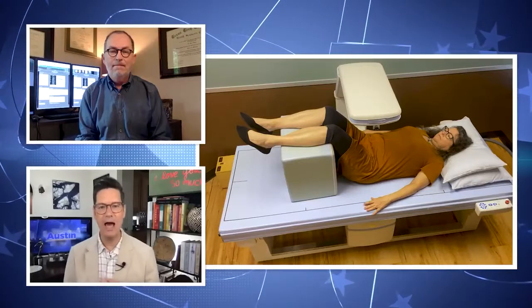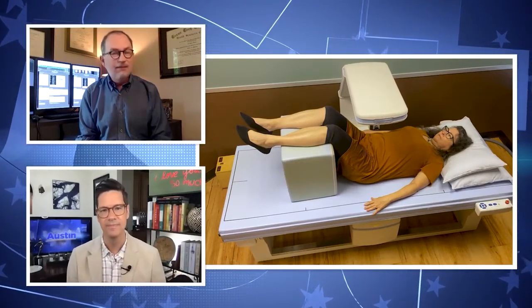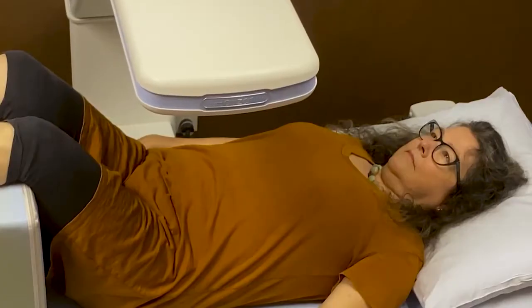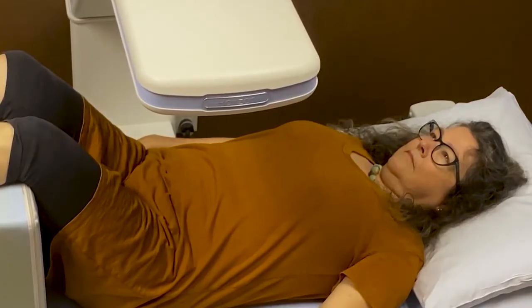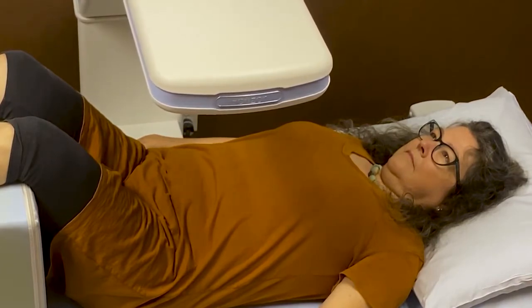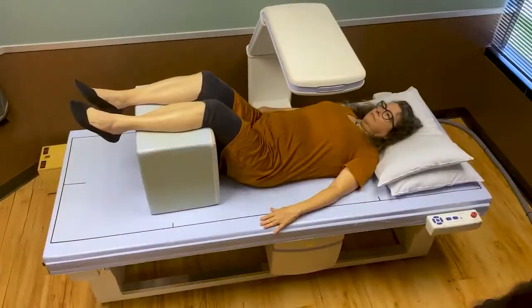About how long does an exam like this take for your typical patient? Less than five minutes — it's not much of a time constraint. In fact, many of our patients come in and the female patients will have their screening mammogram done and then have the bone densitometry done at the same time. All of that power and information in such a short amount of time — it really is pretty amazing.